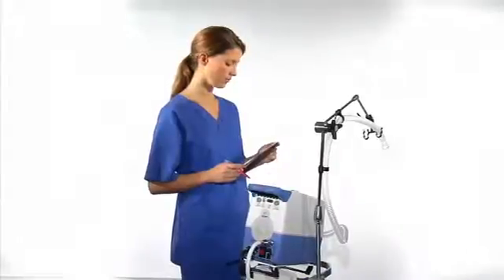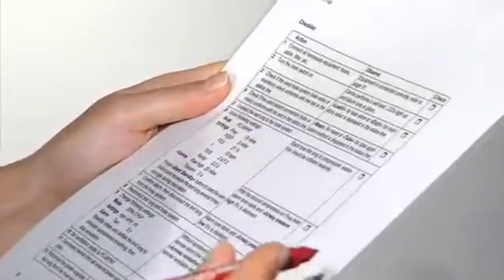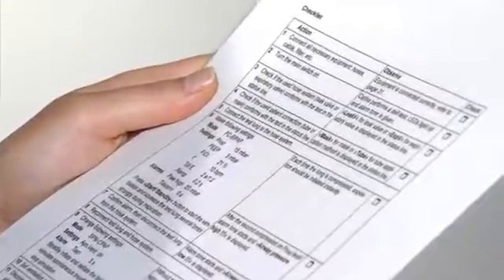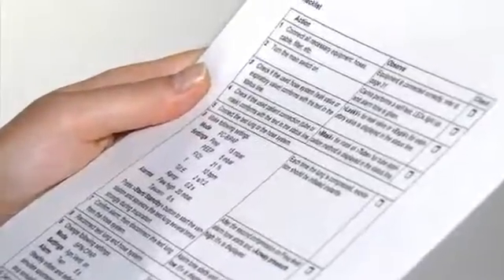Before connecting the patient, we recommend performing a system check to ensure the device is fully functional. The checklist for the system check is contained in the Carina instructions for use. The system check is fast and easy to perform and takes as little as five minutes.